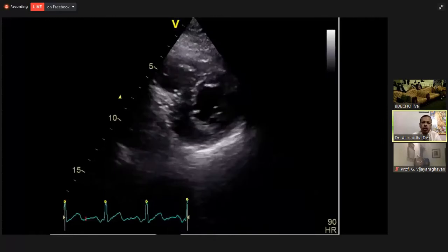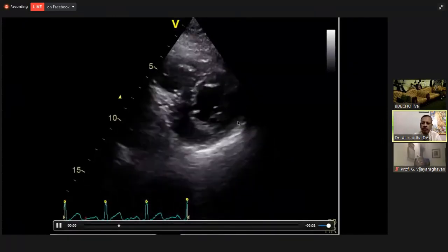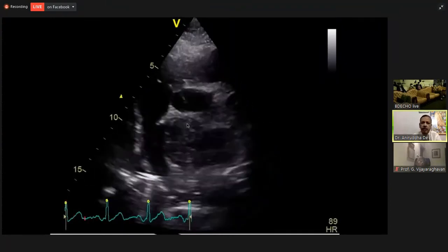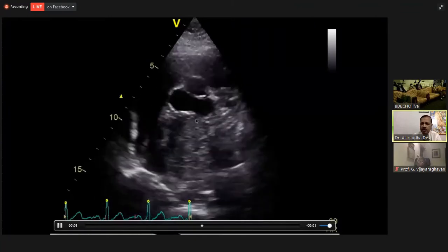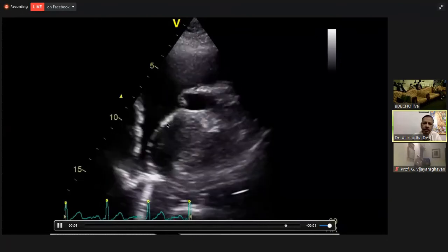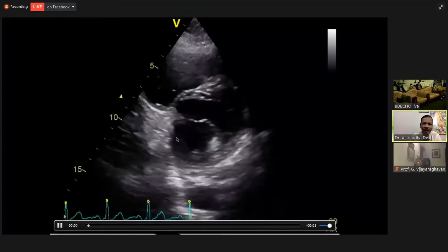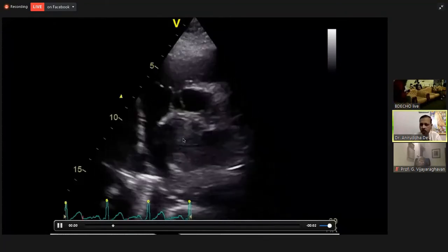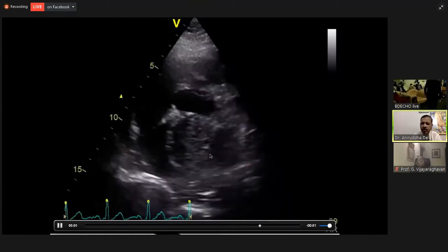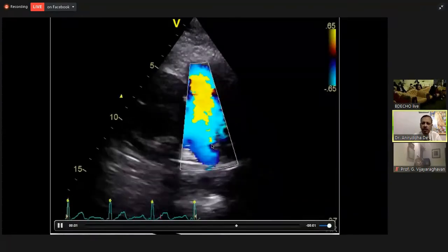In the short axis view, you can see the LV is contracting fairly well, and so is the RV. In the short axis view at the aortic level, you can find the same mass in the left atrium. There is a clear gap around the LA, but the mass is variegated in appearance, and some areas look like cystic degeneration. The RV inflow, outflow and pulmonary arteries are all normal.